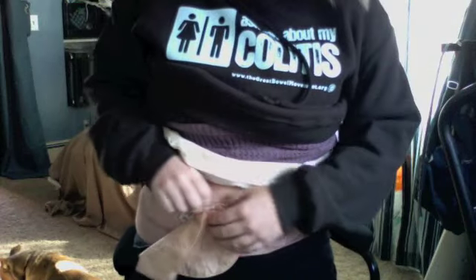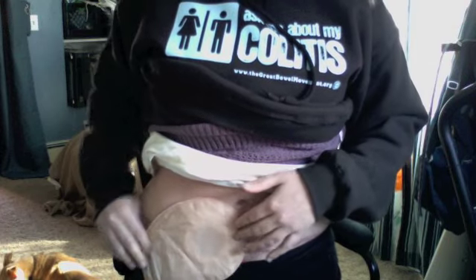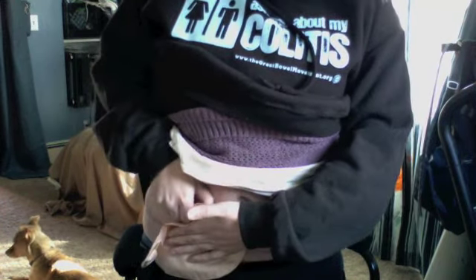And yes, there is a little bit of a collection down here, but it's really not that bad. Sometimes if I was having a really high output day, I would turn it a little bit like this. So it was still sideways, but angled downward, so gravity would take everything down. So the other things that I wore, let's leave it like this, is about how I wore it.